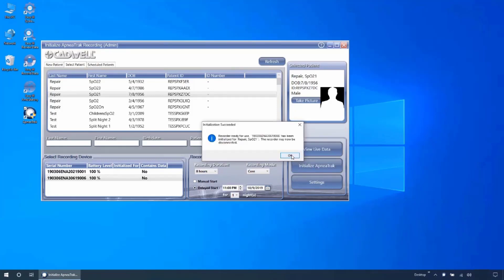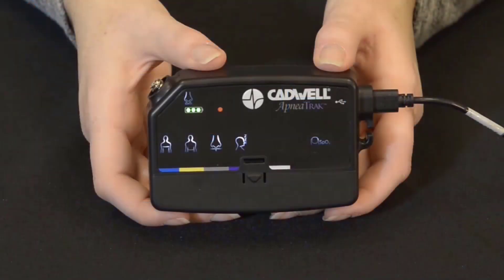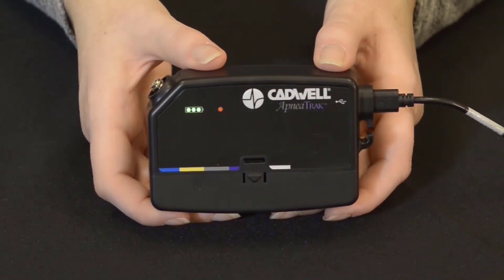The lights on the selected device will flash and you will see a confirmation message indicating the device has been initialized successfully. The confirmation message includes the device serial number and patient information. The device is now ready for use and can be disconnected.